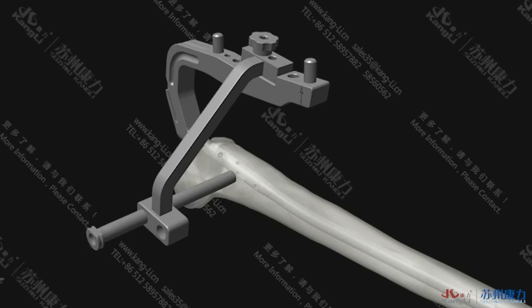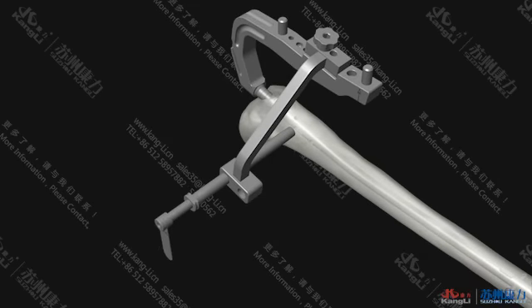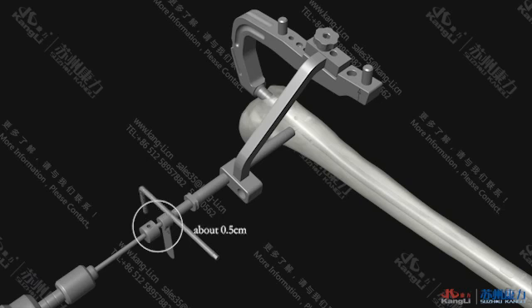Remove the soft tissue separator and insert the phi 4.0 inner sleeve and phi 4.0 drill bit to drill. When the first layer of the bone cortex is drilled through and the drill bit reaches the inner wall of the contralateral cortical bone, adjust the distance between the ball spike on the phi 4.0 drill bit and phi 4.0 inner sleeve to about 0.5 cm, using an SL wrench to protect the soft tissue of the contralateral skin.